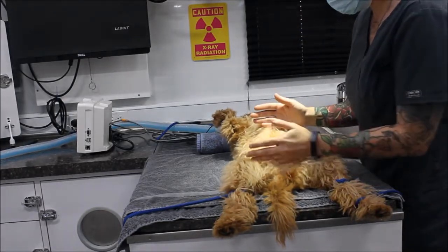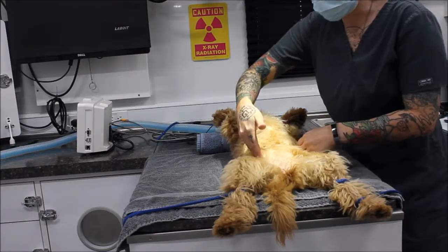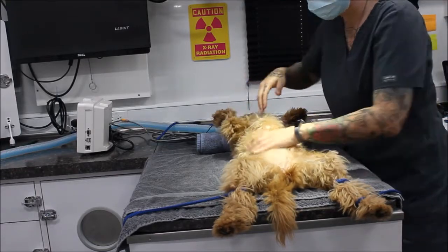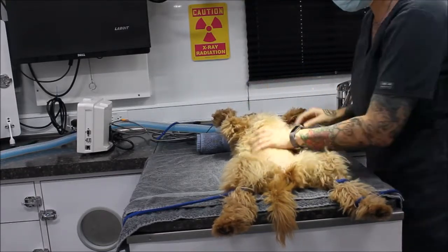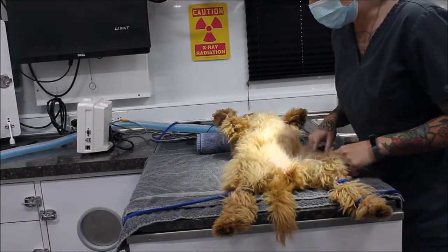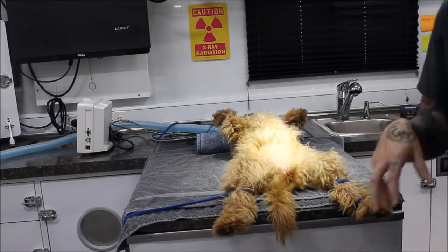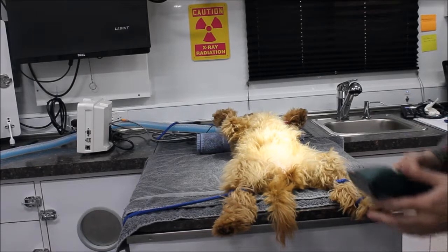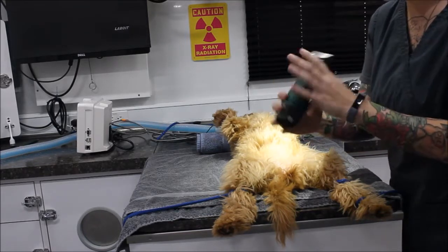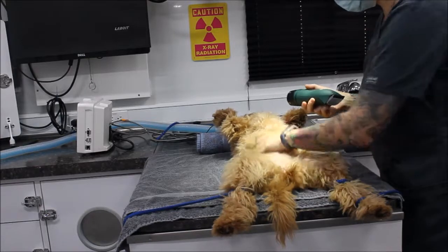We're going to be shaving from her xiphoid process down to her pubis, and then laterally on the edges to the ribs, removing all that hair. Then we're going to do the first dirty scrub here in the prep area, and after that, I'm going to move her into the OR area to do the final scrub. First, I'll get my clipper blades with a 40 blade and start shaving.